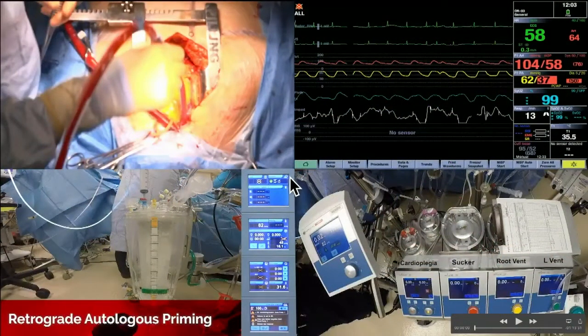Okay, so what we have here is a multi-camera view of everything happening in the operating room during the procedure between the surgeon and the perfusionist, and anesthesia. To some degree, yes, anesthesia is included. I'm not excluding them, but you don't see anesthesia in this. For my anesthesia brothers and sisters, yes, you are included in this, but he just can't see you. Maybe next time, Patrick, you can add some more cameras and we'll do anesthesia too.